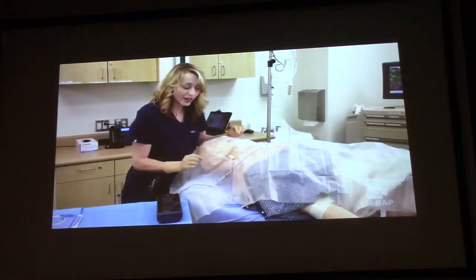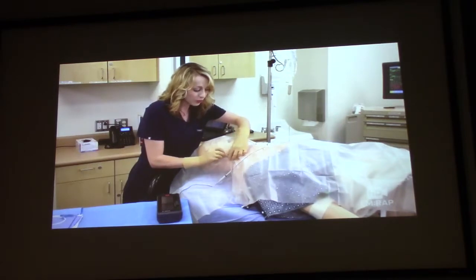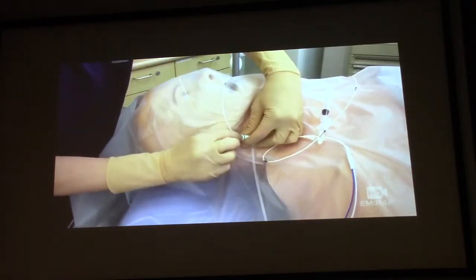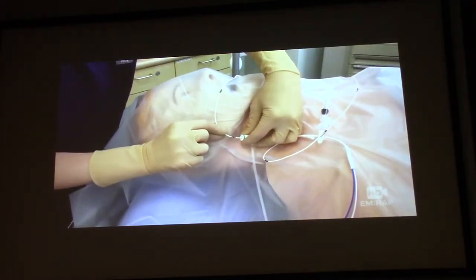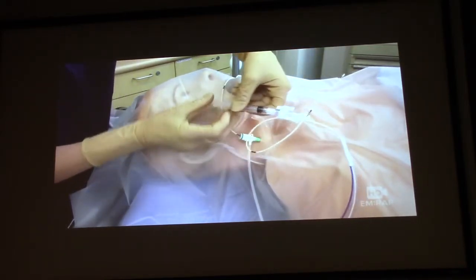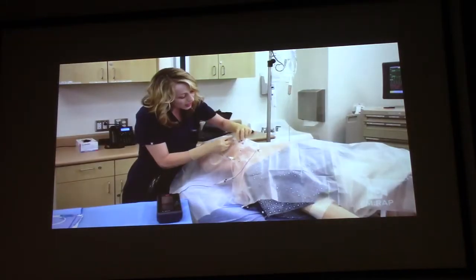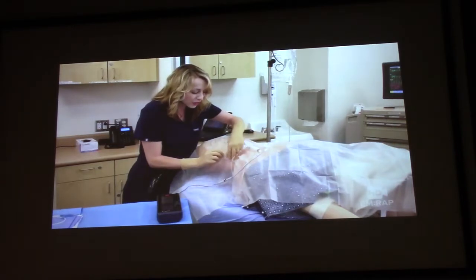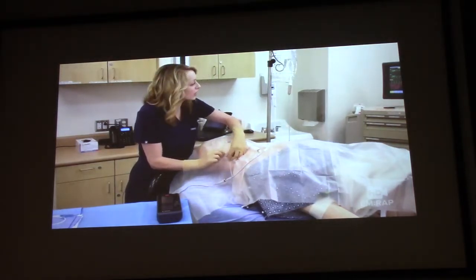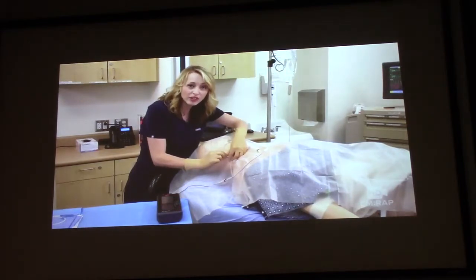Now we're going to insert the wire a little bit further so that we can float the balloon in. So we're going to push that wire down to the 30 centimeter mark, which of course is indicated by the 3 black lines on the pacing wire. Now it's at 30 centimeters, and I'm going to go ahead and inflate that balloon. And now, probably another 5 centimeters or so, and as I do this, I'm looking at the cardiac monitor, and I'm looking for that injury pattern that looks like a STEMI in lead V1. That's it right there. And you can confirm this on ultrasound if you have it.